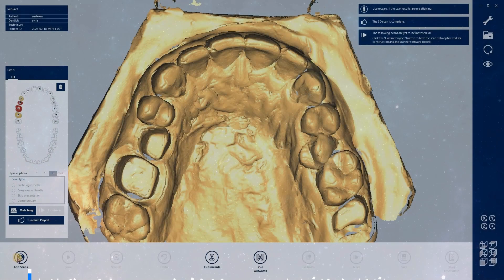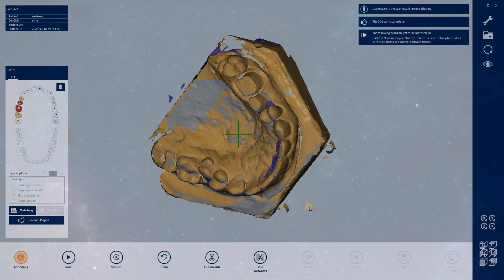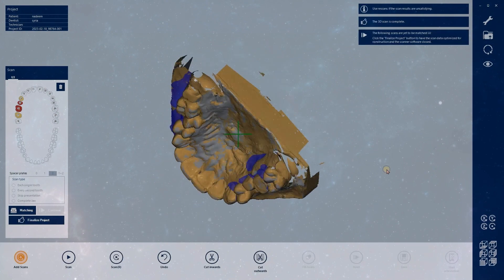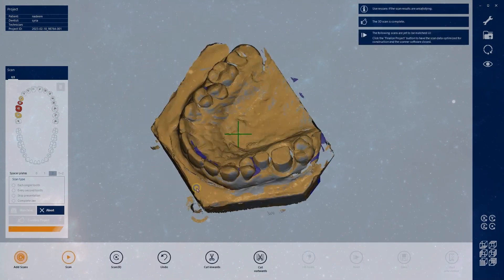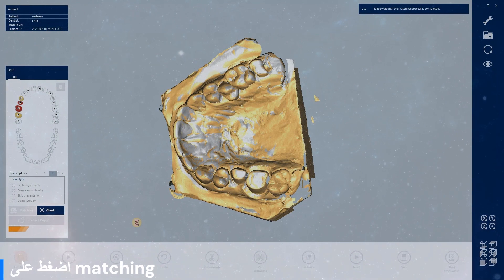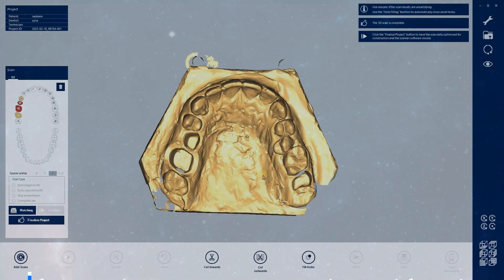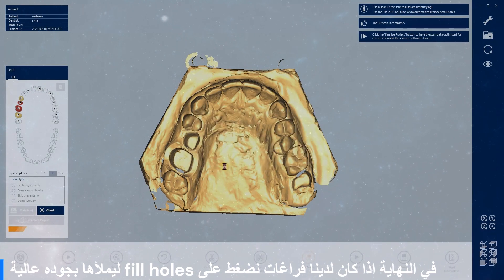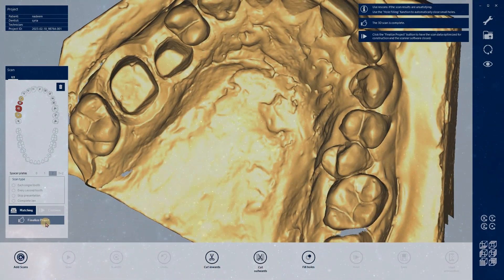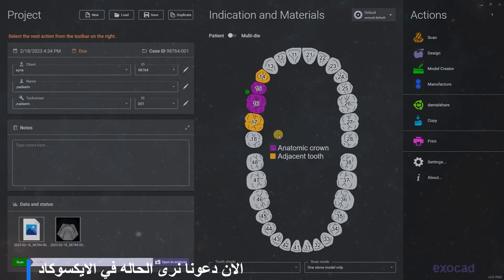If we have some holes, we will put some add-on on it, then press matching to make a match to all the cast. In the end, we will press fill holes — if we have some — to fill all our holes with high quality. Now let's see the case in ExoCAD; press the design button to see it.